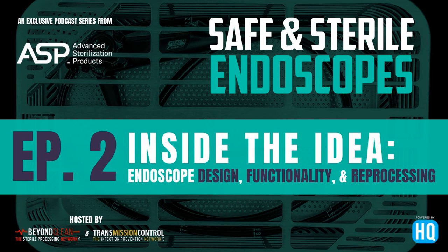And as we know over the years, we've had the Urology Society as well as people pushing from the pulmonology side. That's kind of a gray area. Does it fall under SGNA from a GI perspective, or does it fall under another organization to follow from the respiratory side? So when I was a GI nurse manager, we did do bronchoscopes in our department. And we had to move into other areas to do them because we needed those positive and negative pressure differences for those procedures. So it does make it more challenging. So then that's where the discussion is, what department does it fall under? And then who's reprocessing? Is it going to GI? Is it going down to SPD? So just making sure that all the departments know what's coming to them so that they have the proper tools that they need, and disposable brushes and things like that to use.